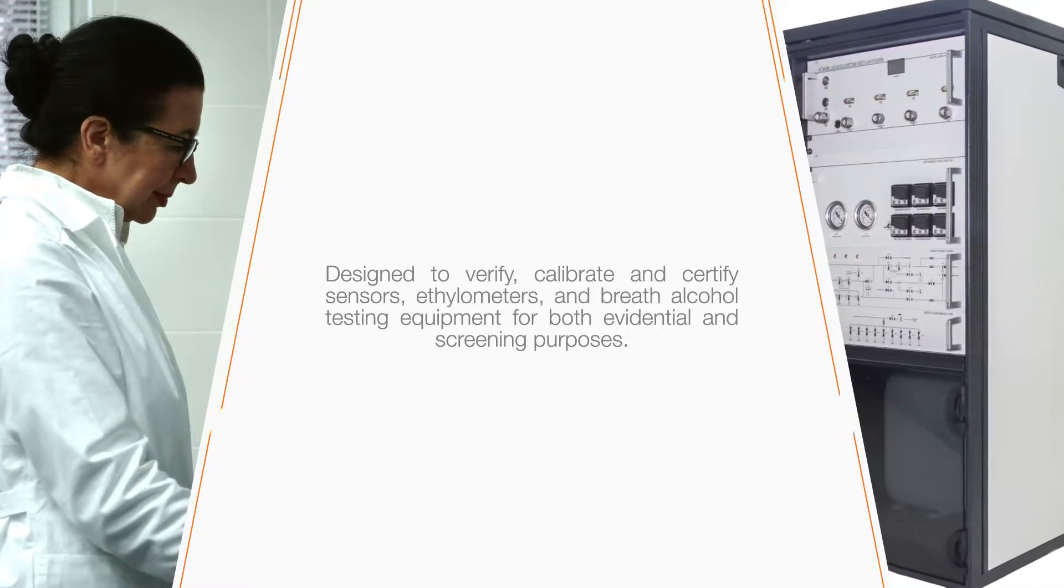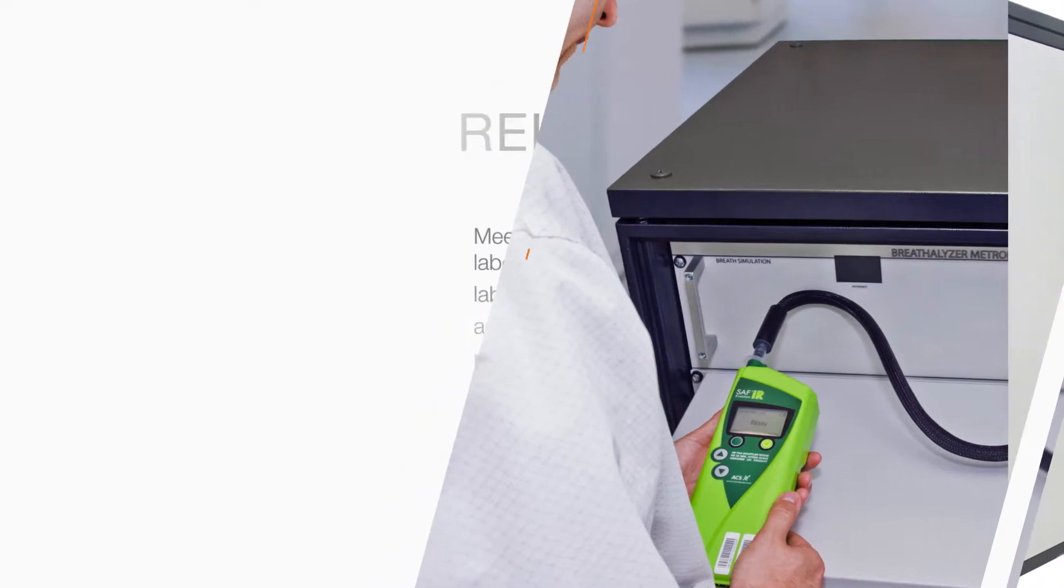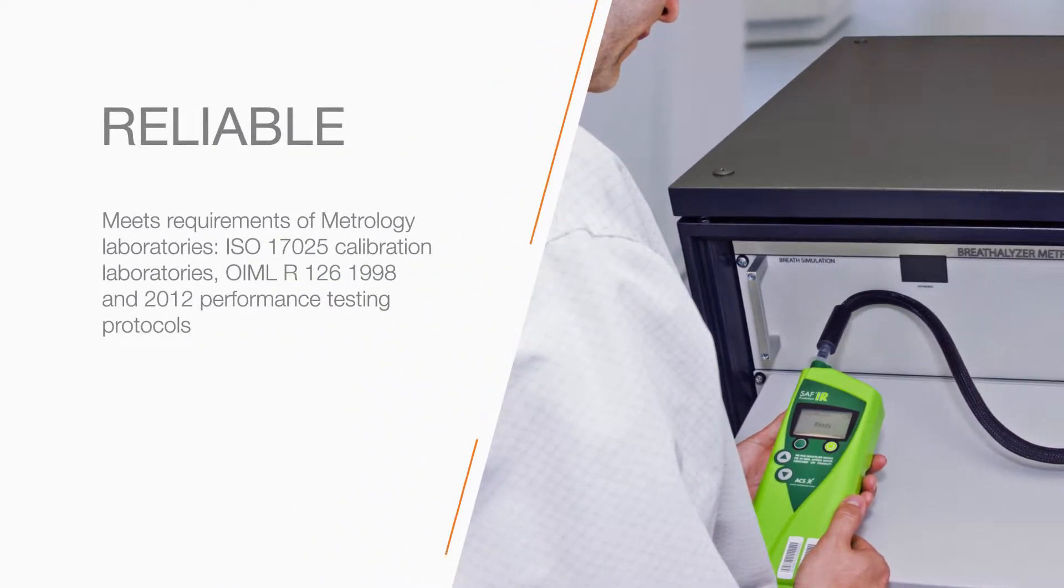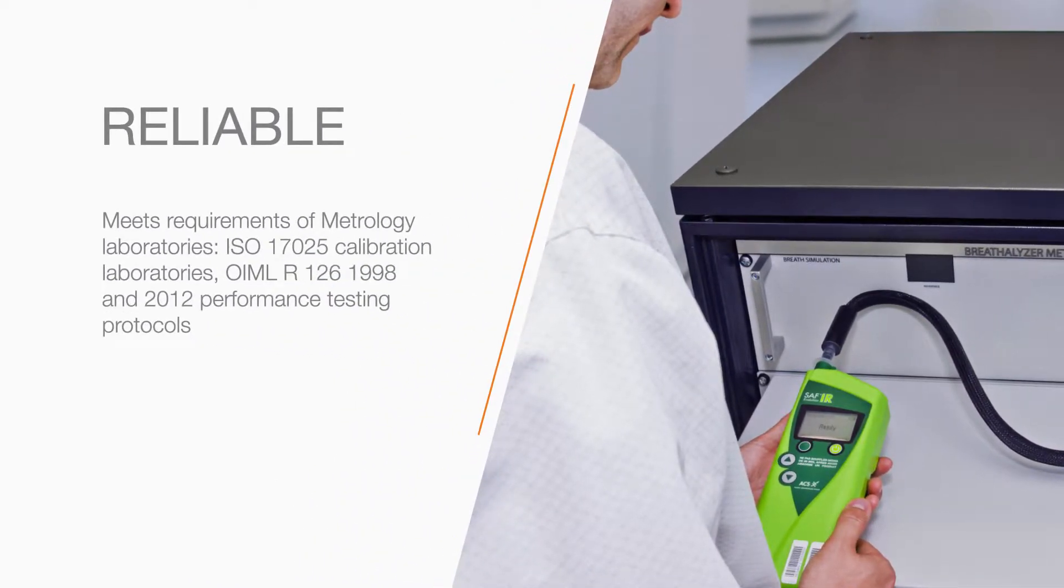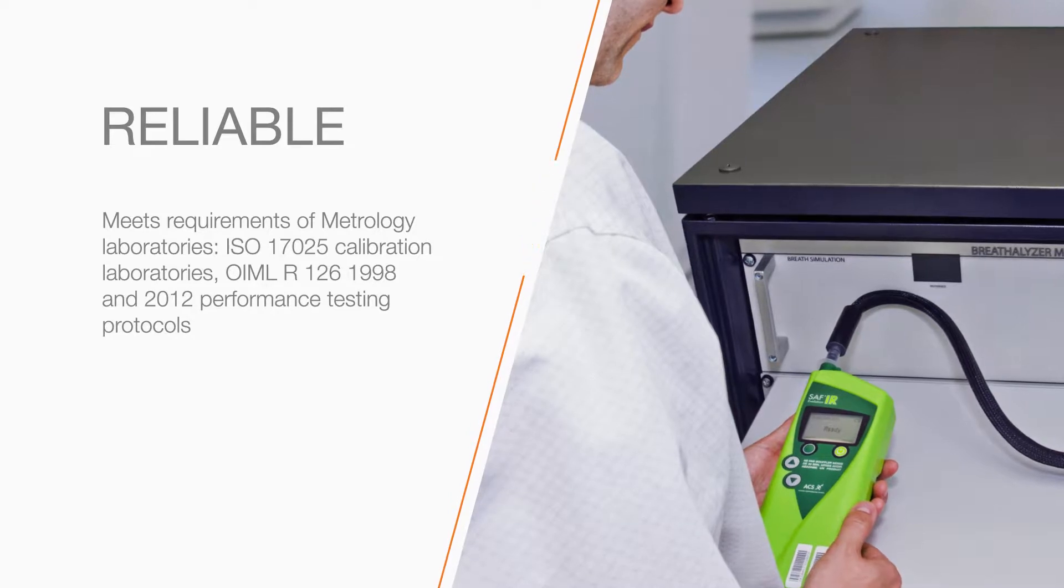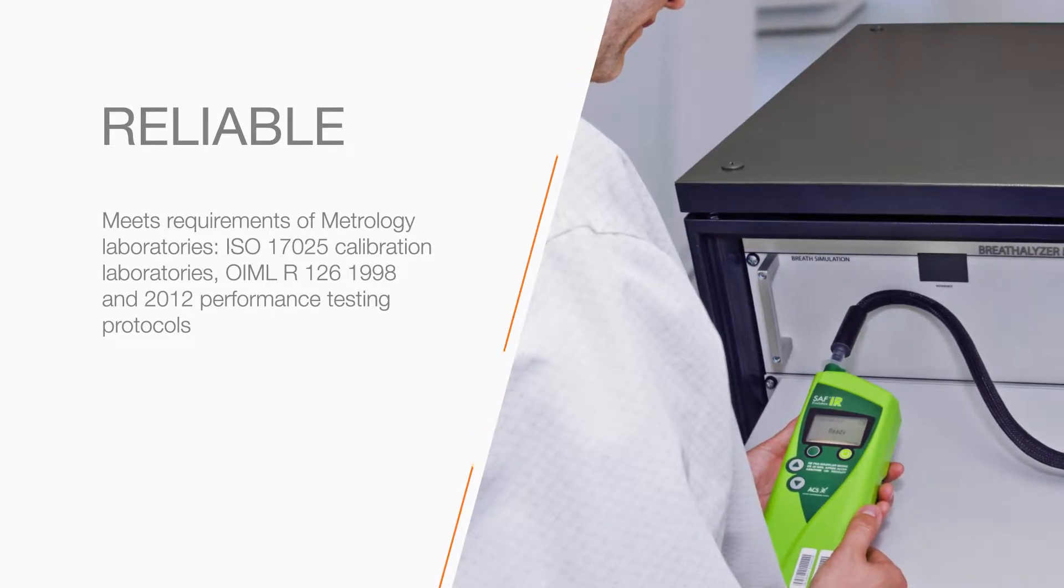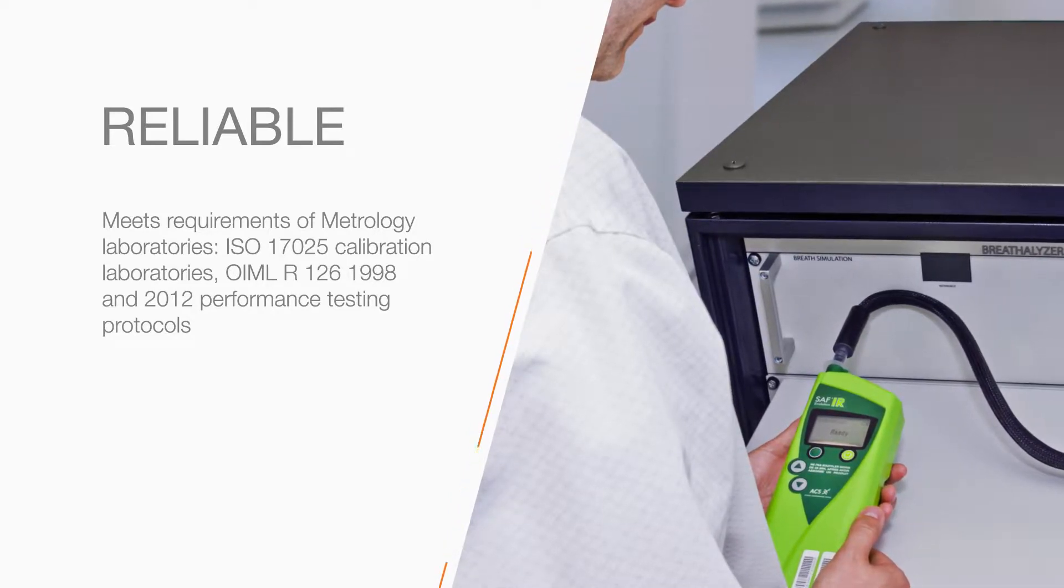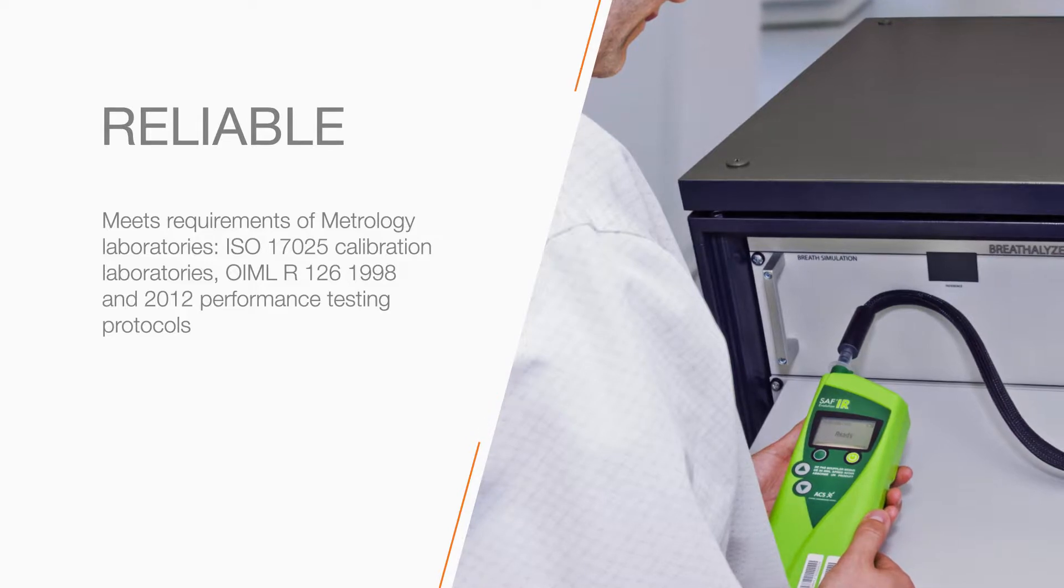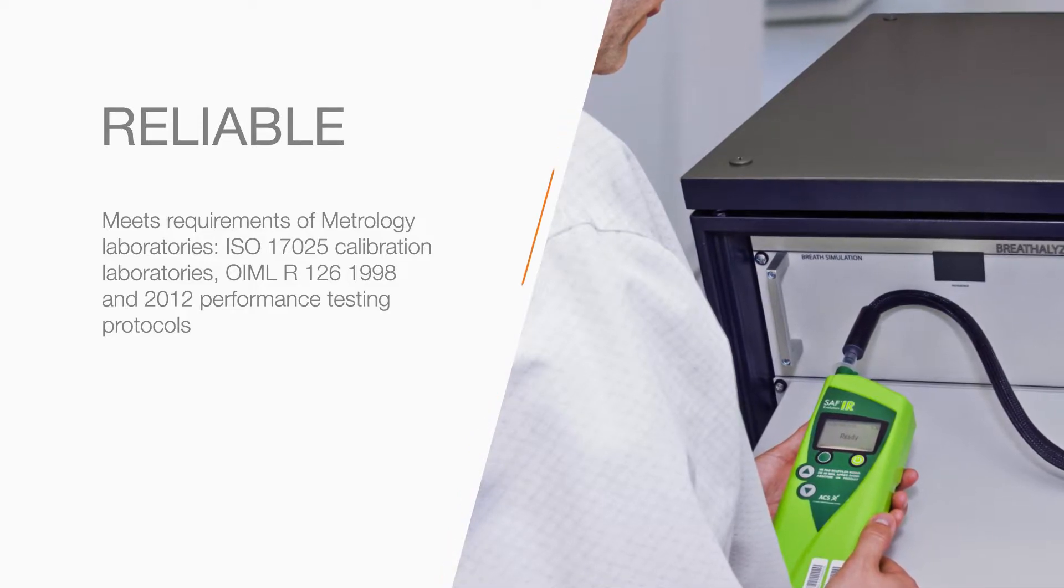Meeting requirements for use in metrology laboratories, certified calibration laboratories, and performance testing, the Metrological Test Bench allows laboratory technicians to create custom breath sample mixtures.